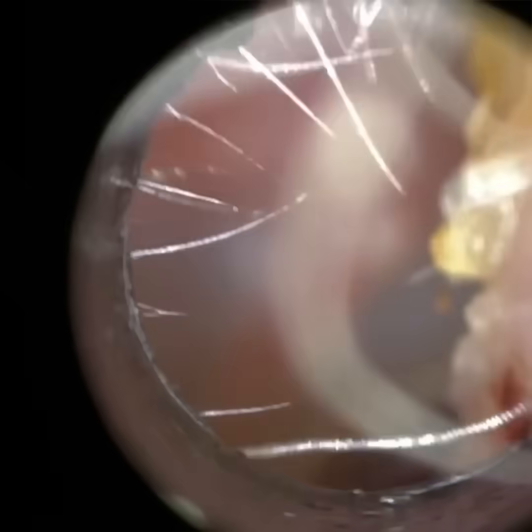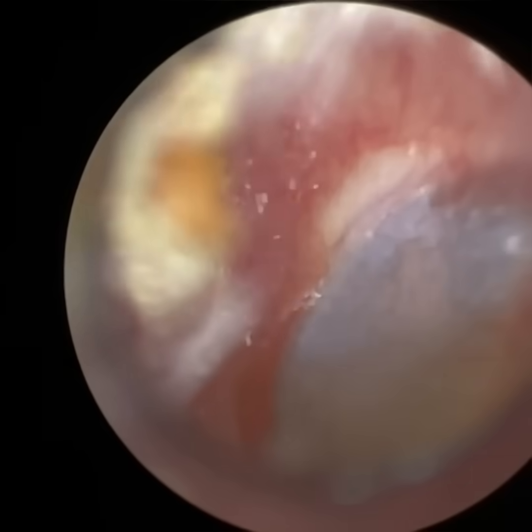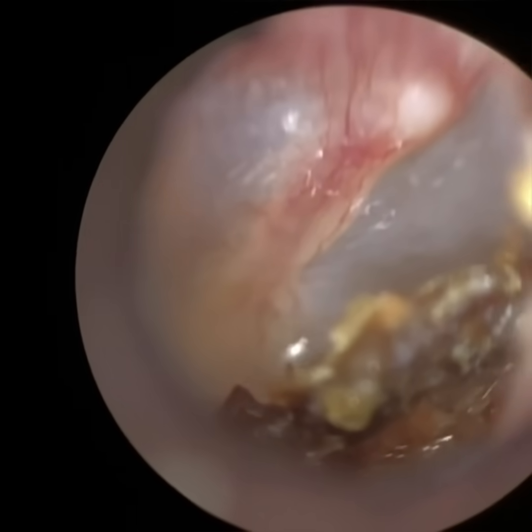You see it's quite a few hairs, almost like whiskers near the entrance. Oh, it's a sizable plug out. Gonna stretch the ear open. So the occlusion's more or less gone, but there's just a bit of keratin at the bottom. The eardrum's visible there. Just having a nosy around. Again, I'm just stretching the ear open.